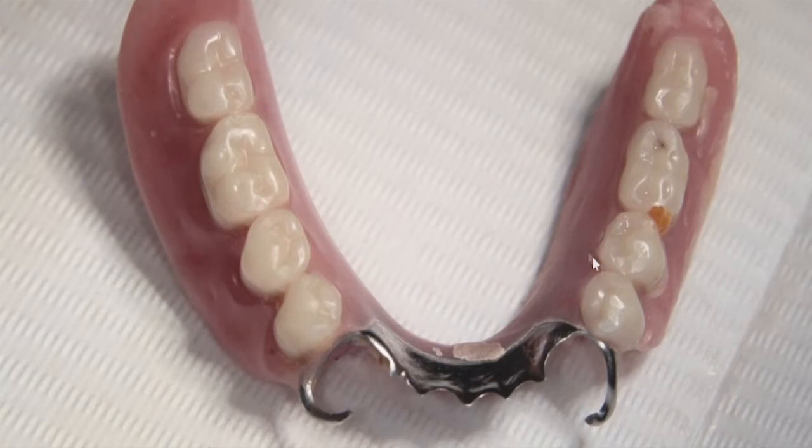So now it'll be here, but now we will have the benefit of circumferential clasping and locator in this area and in this area in order to increase the retention of the denture base. She and her daughter have discussed it thoroughly, and even though this lovely lady has some senile dementia, she's very much pleased with the treatment recommendations.